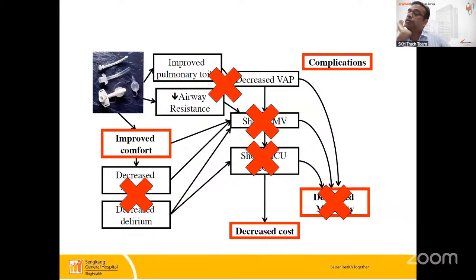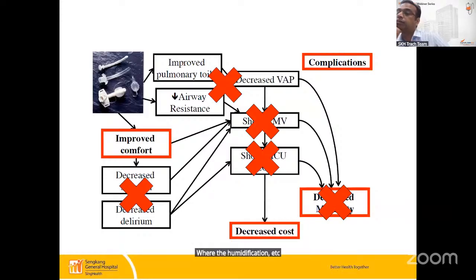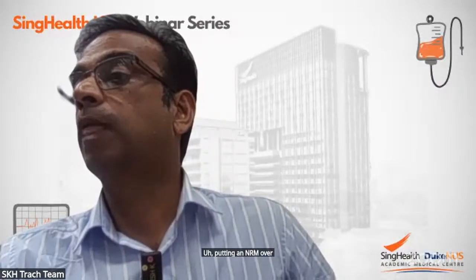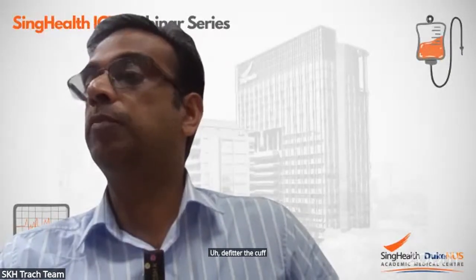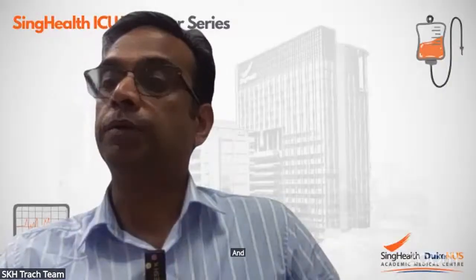In an emergency, there's a question: in an emergency or in A&E for desaturation, where the humidification, etc., is not set up yet, do we put an NRM over both the trachea and mouth? It depends on what the emergency is. If the tube is blocked, for example, putting an NRM over the trachea may not work. So you may need to deflate the cuff. If it's still blocked, you may have to remove the tube and then put the oxygen through the stoma and also the mouth.